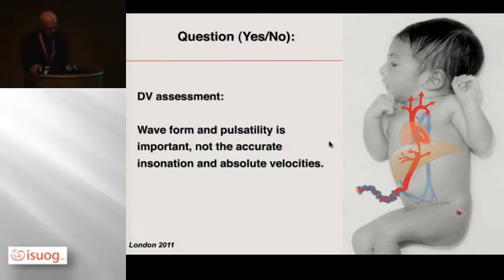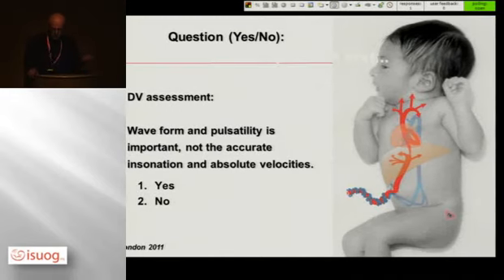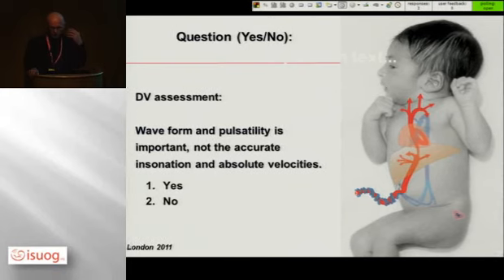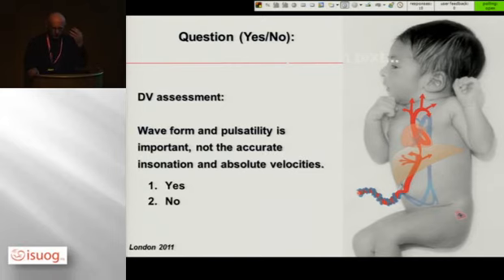We had this question, waveform and pulsatility is important, not accurate insonation and absolute velocities. That's certainly true if you're going to assess heart function, or if the baby has problems with the placenta and has an increased pulsatility index or impedance in the placenta, then you have cardiac function changes. But if you would like to dig a bit deeper into some of your patients, maybe this is the kind of thing you have to train on to get a good recording of the ductus venosus, starting using also absolute velocities. Thank you.